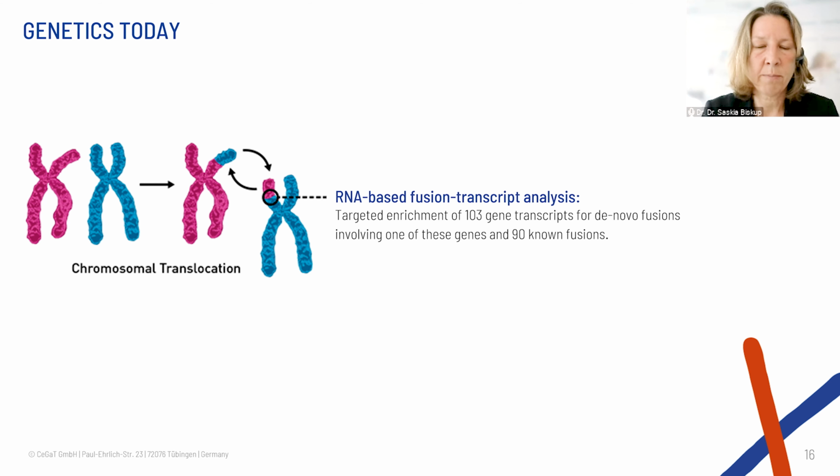If a tumor is driven by a fusion, it's the main driver, and it makes it a perfect target for treatment. Let's say you have a tumor where you overlook an NTRK fusion, you do not know because you don't see it, and then you don't target it. You can be sure that 100% of these tumor cells are driven by the fusion, and so you need to know the fusion. And this is our motivation why we developed this test. We don't want to have a single patient, even if it's a rare event, where we overlook it. We need to know.